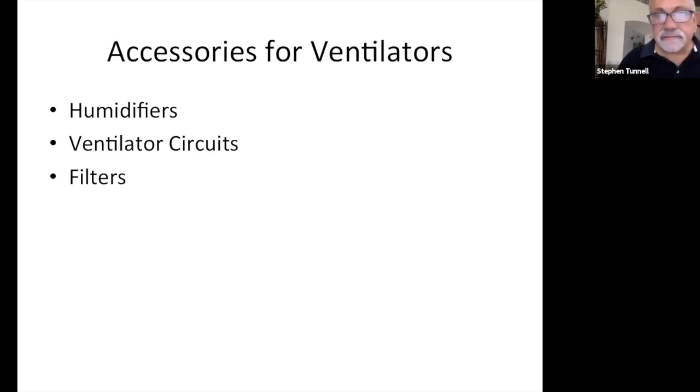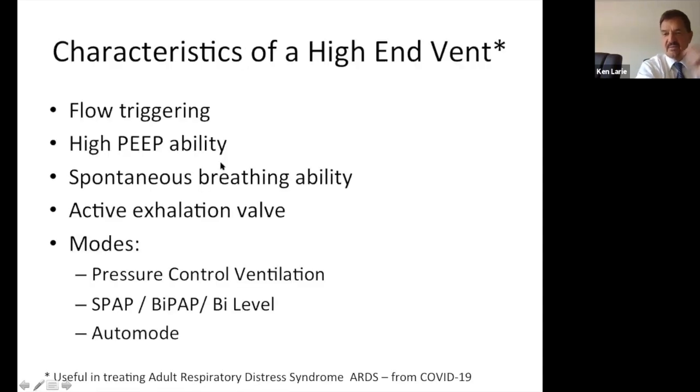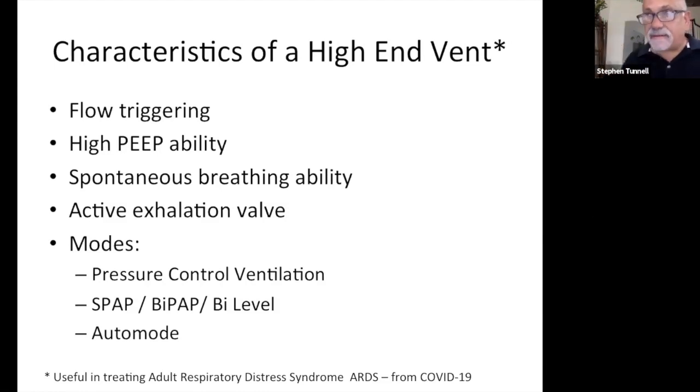a continuous revenue stream. Steve, is a ventilator circuit just the tubing in and out? Is that what it is, or is that something else? No, it is exactly what you just said. It's that tubing in and out. There's also a chamber that's, for lack of a better word, the coffee pot, a little hot pot that heats the water, and the air flows through like a humidifier, like the humidifiers that you would, funny enough, use maybe for your child if he's got a little bit of bronchiolitis. And in this case, the gas is directly driven over that heated water, and it picks up humidity and goes to the patient.